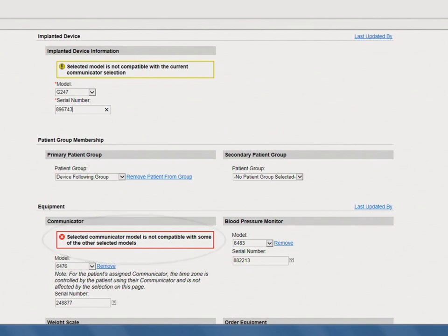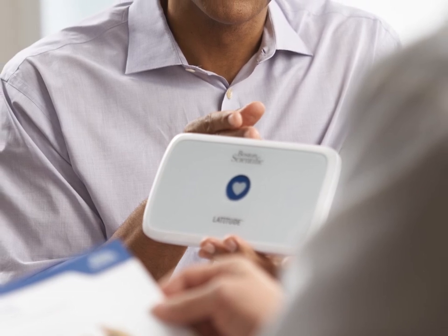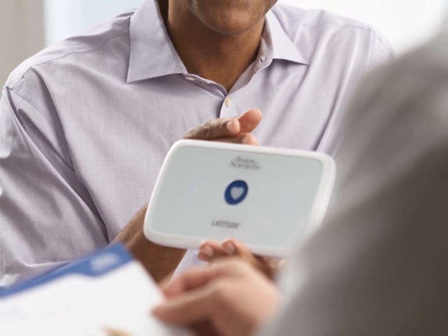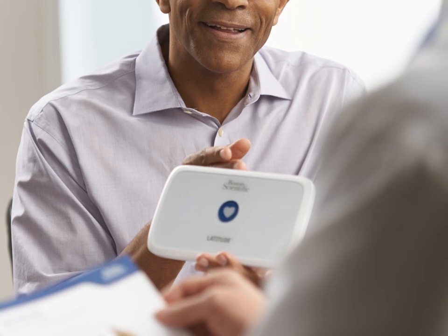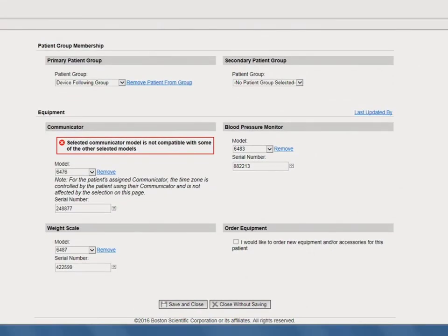Since the current communicator is not compatible with the new implanted device, you will need to distribute a new communicator to the patient. If you have communicators in your clinic, you can hand a communicator to the patient and update the model and serial number in the Equipment Information section. If you prefer to ship a communicator directly to the patient's home, you can complete these steps within Latitude Next.